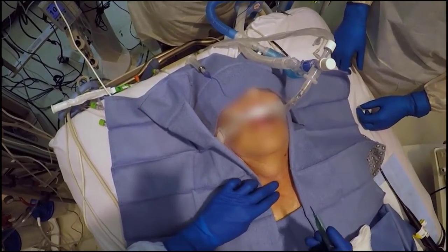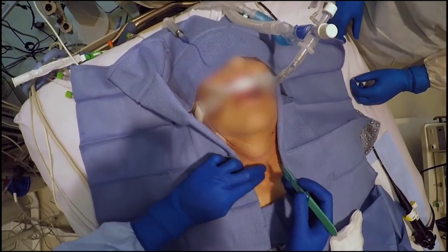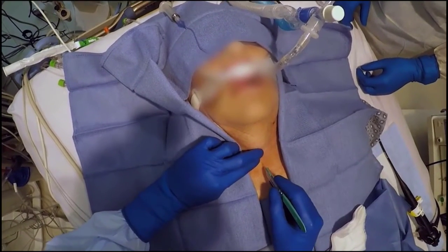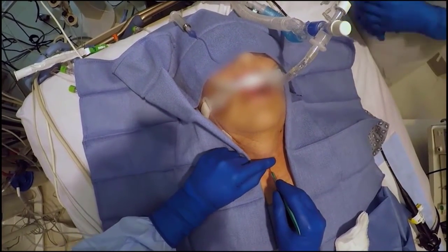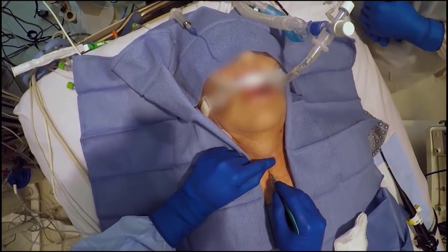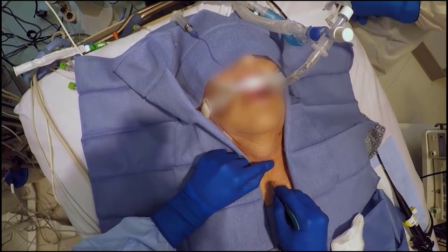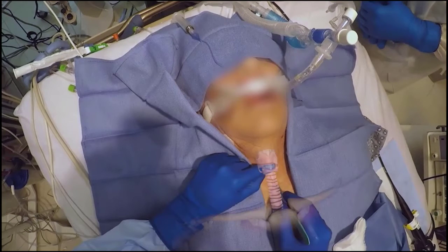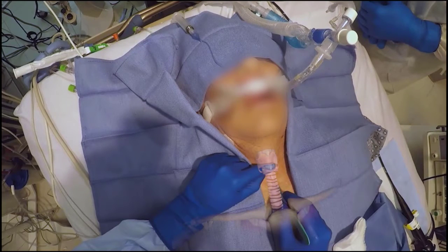Sterilize and drape the anterior neck, making sure that the draping allows easy access to the oral endotracheal tube. Next, make a two to three centimeter vertical neck incision that directly overlies the trachea below the cricoid cartilage.